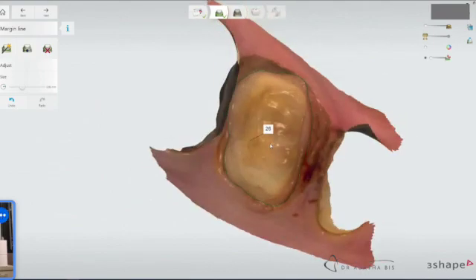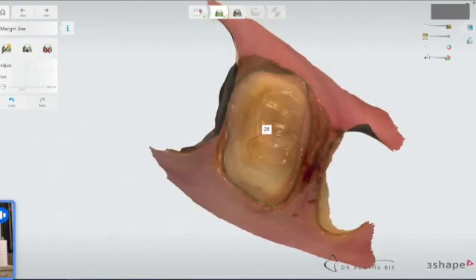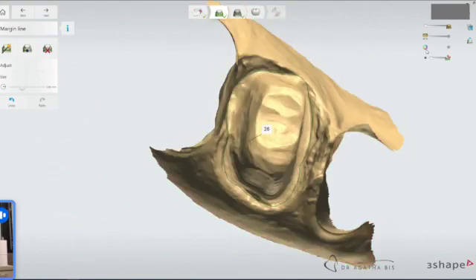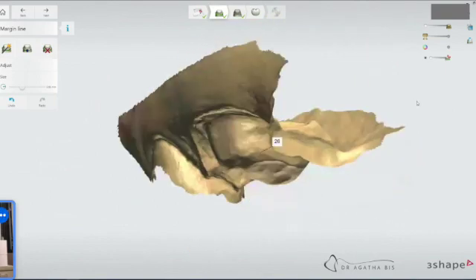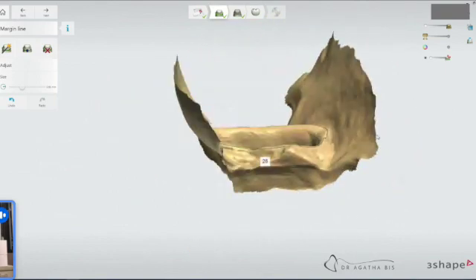So then I'm going to switch it to the stone model and flip it over. That's sort of the key to seeing the margins in difficult areas, especially if you have a little bit of bleeding or you're not able to use retraction cord, things like that.